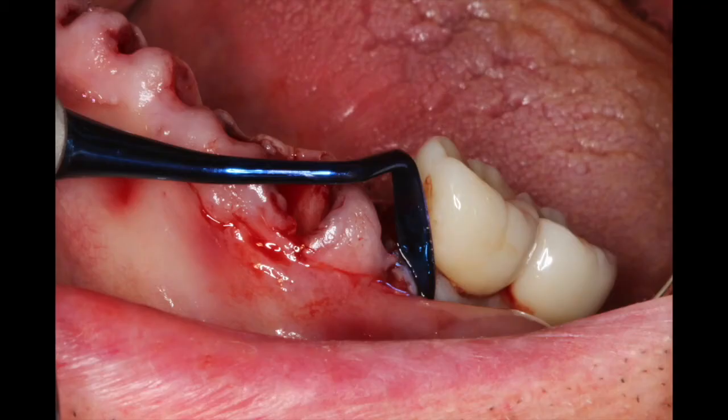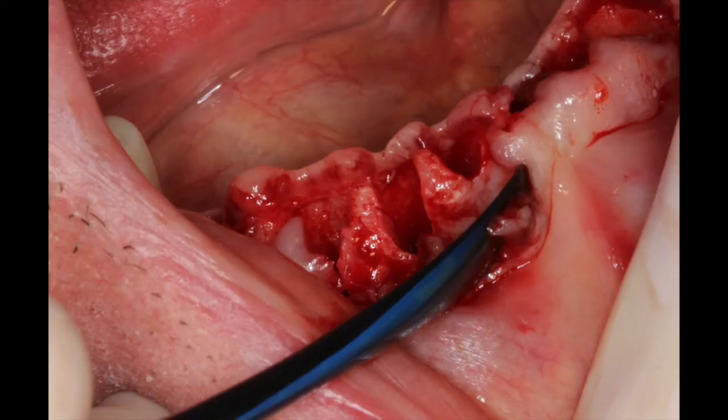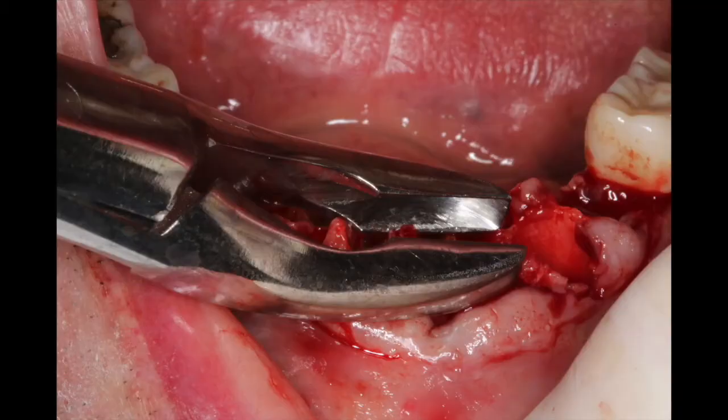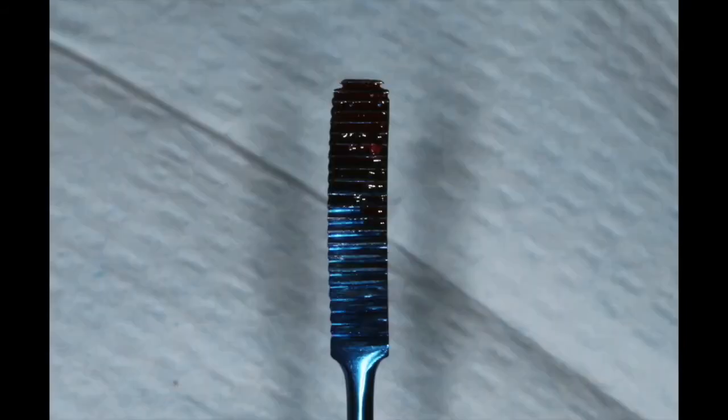Here I'm taking my orban knife and making a nice controlled incision into the extracted site, elevating the facial and lingual bone so that I can actually see any defects that may be present due to resorption of the roots. I'm going to take a rongeurs and simply remove the spicules, and a bone file will flatten them and make them very flat and smooth.